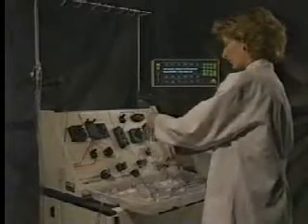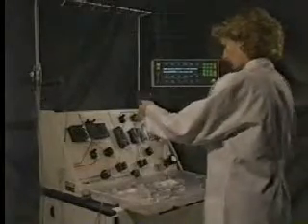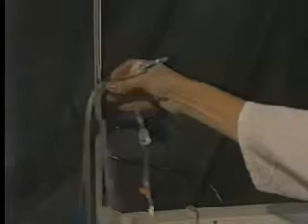Lift the return line coil from the package and remove the white paper tapes. Notice that the 2 lines attached to this connection are taped together with blue tape. Hang the return connection onto the hook on the left side of the IV pole.